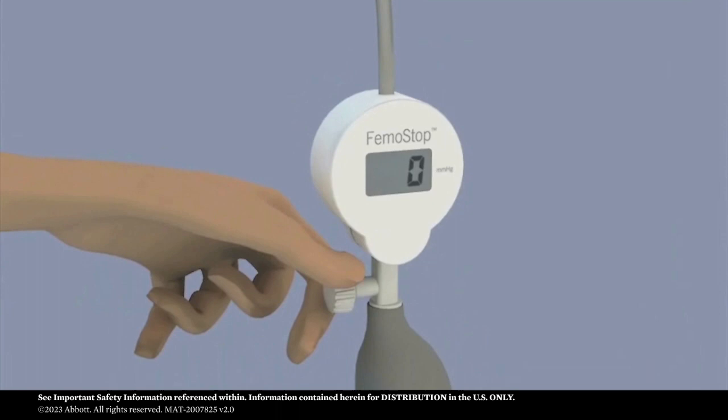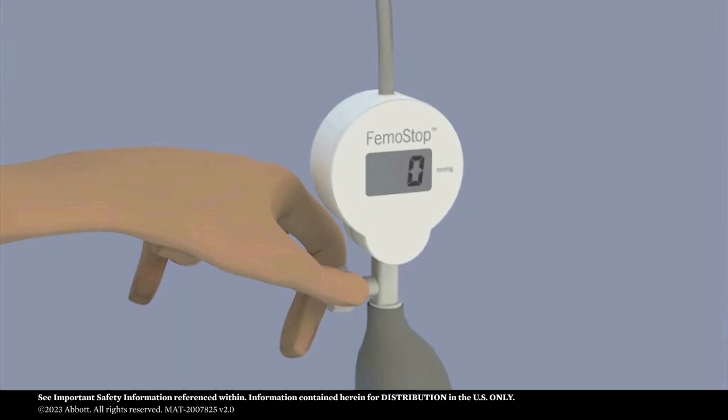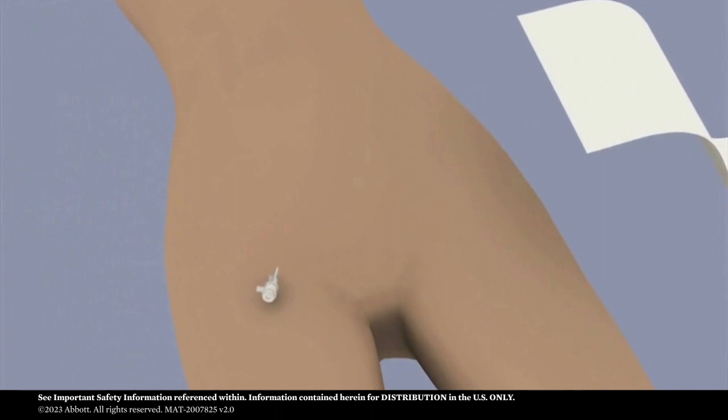Close the control knob. Please note: the control knob must be closed when increasing pressure and open when decreasing pressure.